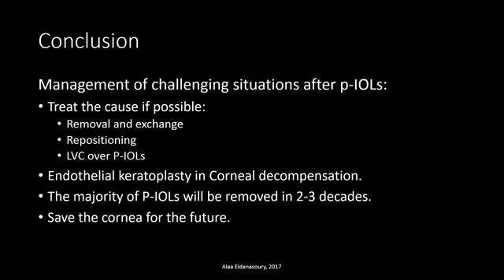So to conclude, management of challenging situation after phakic IOL, you have to treat the cause if possible, the repositioning, removal, or exchange of the lens. Endothelial keratoplasty is used in corneal decompensation cases, and always keep in mind that the majority of these lenses will be removed 20 or 30 years down the road, so save the cornea of these patients for the best possible outcome after phaco surgery in the next few decades. And thank you for your attention.